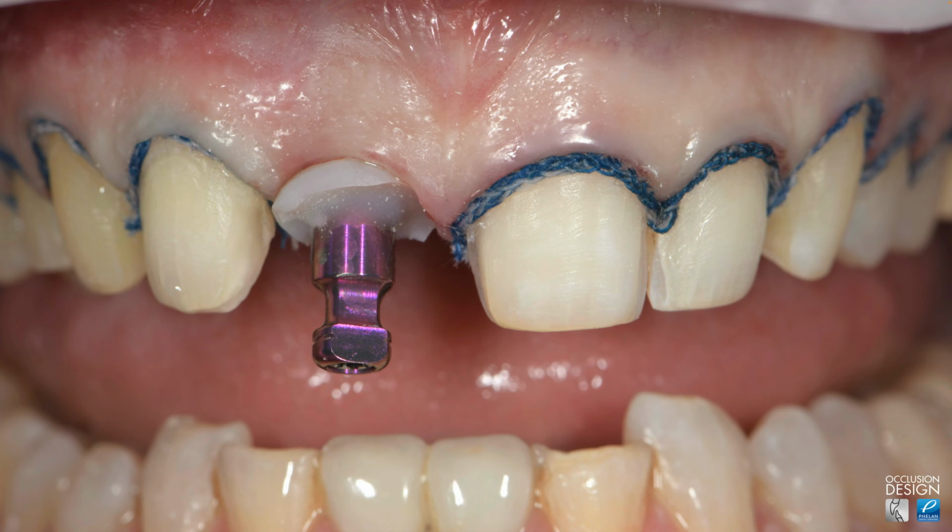And there's a number of indications where I would break contact with porcelain veneer preps. But as you can see here, we didn't. I don't believe we did over here either. So we're trying not to break contact. I'm trying to keep this as conservative as possible.